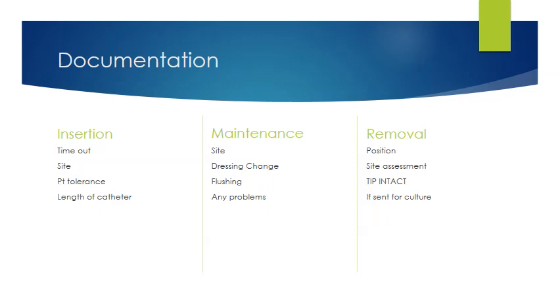Documentation. You have to document your insertion. You have to document while it's in there, or to maintain, and then you also have to document on removal. So whenever you do insertion, you want to do a timeout. You want to make sure that you document the site. You want to document patient tolerance, the length of the catheter when it goes in. How long was it? Perhaps let's look at a PICC line. Whenever they insert those PICC lines, it is documented how long, how many centimeters that was inserted into the patient, so that when we remove it, we can refer back to that to make sure that the entire length of the catheter was removed.